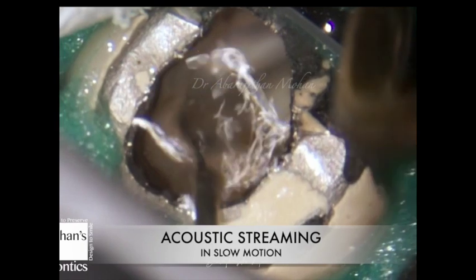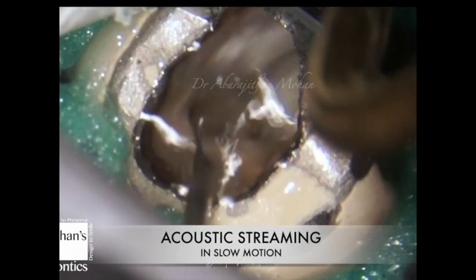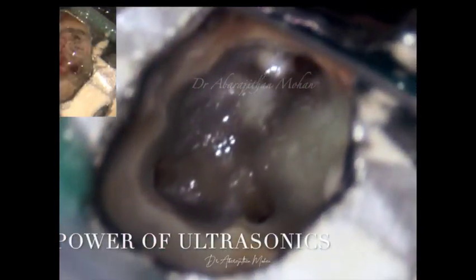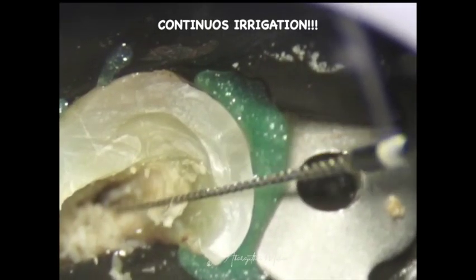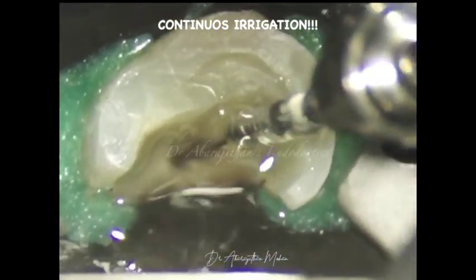You can see the eddy currents flowing through the irrigant, and since it's continuous ultrasonic irrigation we also have continuous replacement of the irrigant. This is very good to clean the canal till the middle third, and once the canal is free of debris we do passive irrigation, followed by activation with sonics. Another example shows continuous ultrasonic irrigation being used in the coronal third.